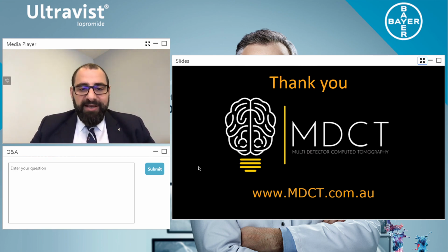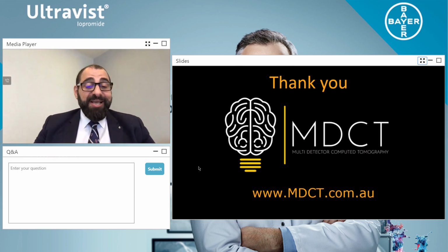Now, Rui has a question. Patient fasting, the 4 hours, is it still ideal or could we reduce fasting time? Rui, that is a fantastic question. I'm so glad you asked, because in the old days when we had ionic contrast, people used to vomit. That's why they had the 4-hour rule.